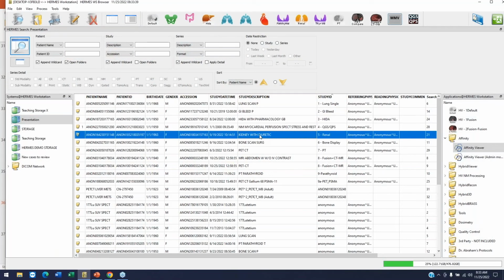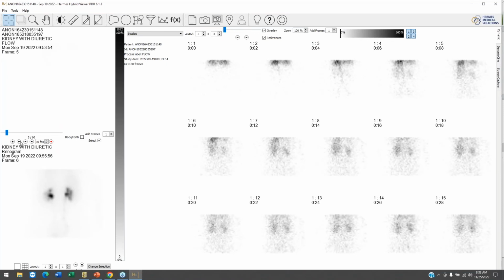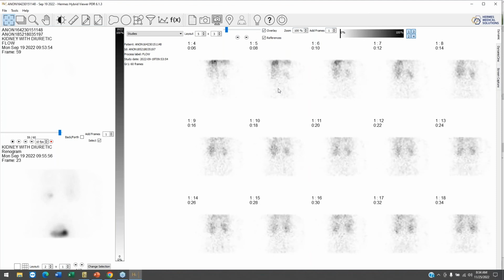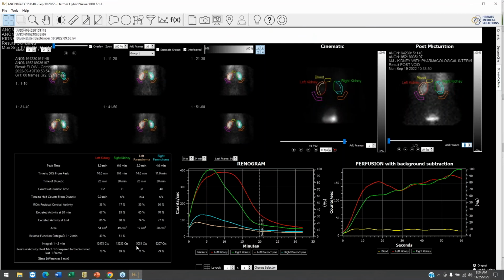Next is an example of a renal scan assessing for obstruction and function. Once again, you can actually cine the images, and you can see the renal activity, which provides good clearance, with some activity localizing to the renal pelvis. Once again, you can look at individual frames to see when the activity in the kidneys was visualized initially. You can go to the screen captures, which show the differential functions, T1/2s, and the curves, and the ROIs, which can be adjusted as needed on the fly.